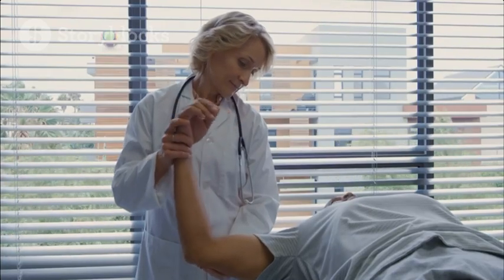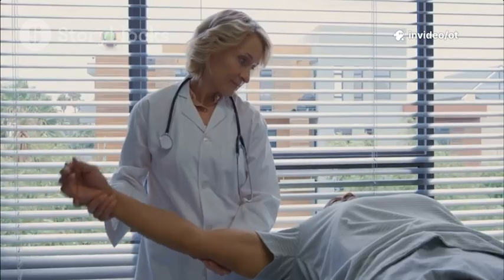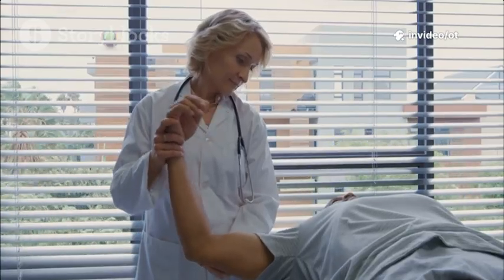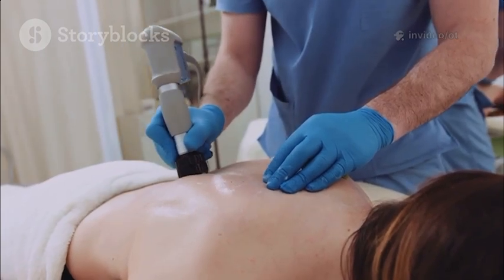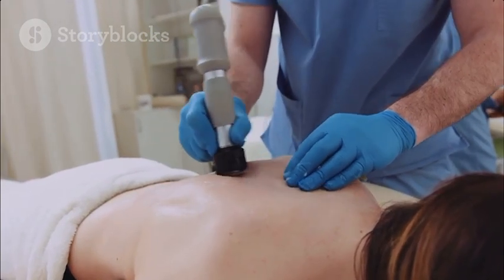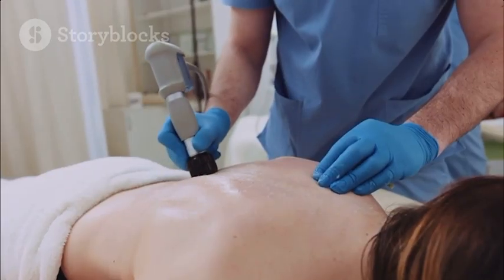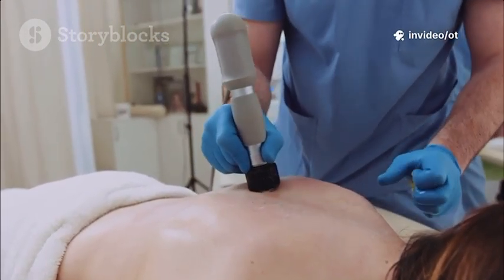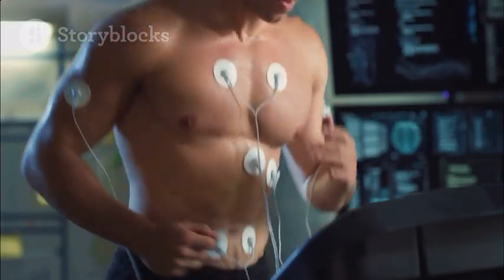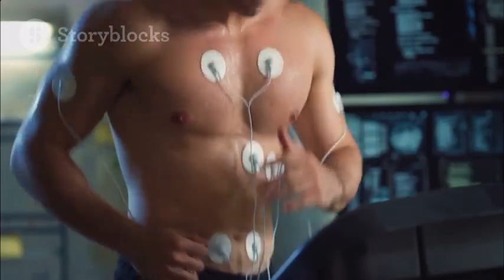Conventional TENS, 50–100 Hz, short pulse width, sensory level intensity for immediate relief. NMES for strengthening, 30–50 Hz to tetanize, cycle 10 seconds on, 50 off to prevent fatigue. Increase to a robust but tolerable contraction. Pad placement is critical, over the muscle belly and motor points. Explain expected sensation and monitor skin under electrodes.